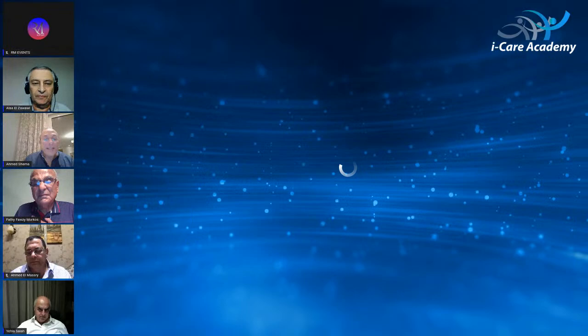This may be like the idea of irrigating under the iris of Dr. Fathy Fawzy. I want to tell you something, Dr. Ali. Sometimes with this technique, you shake and then you find a small piece that comes behind the iris, and you try to get it and you see it and you are sure that there is a piece, and then it's hidden, you can't see it again, and then you try everything to get it and you can't. Sometimes I try hard for minutes and minutes and I can't get it.